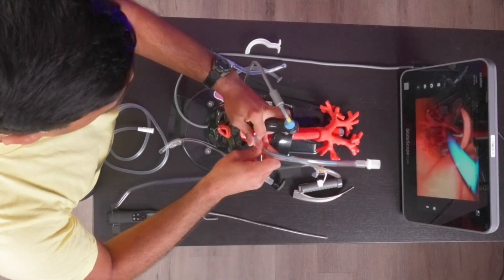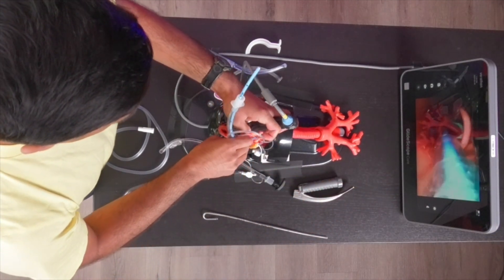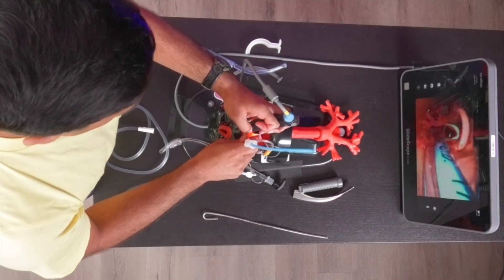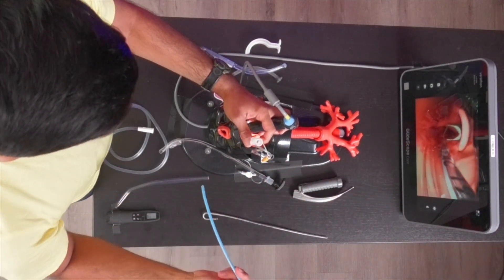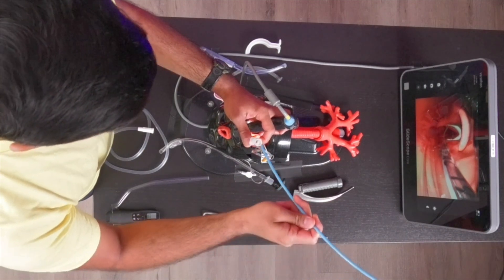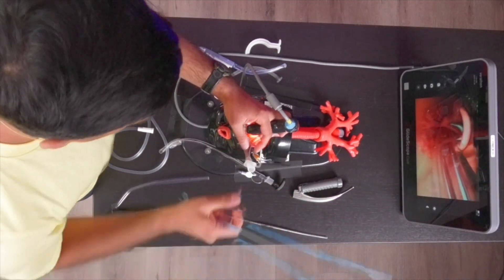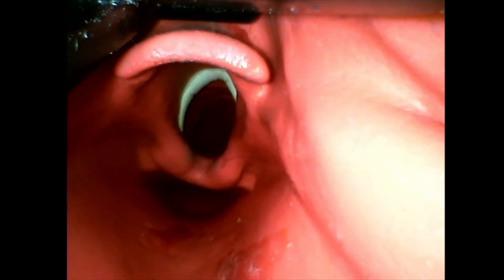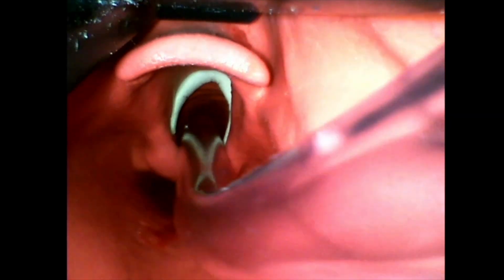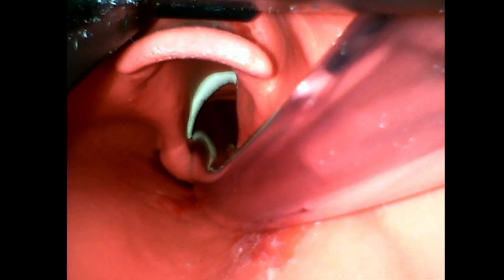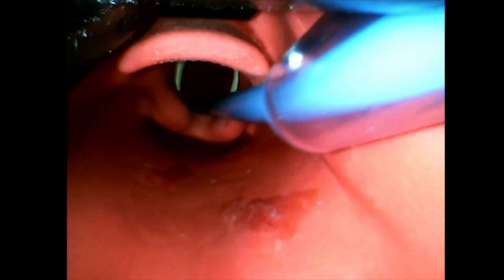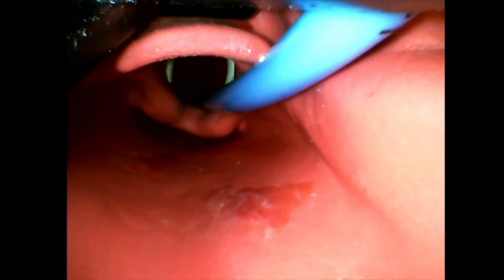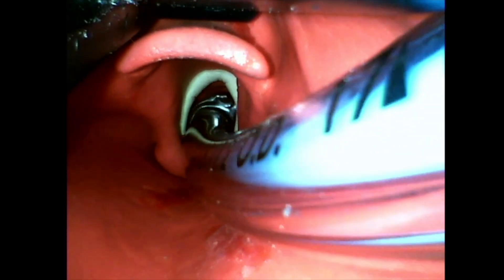Over this bougie, you can pass your endotracheal tube. It really helps to have an extra pair of hands to do this part of the procedure. I always recommend watching the tube pass instead of pulling your glidescope out with just a bougie in place. Once the tube is in, you can pull your bougie out. I'm going to do that one more time on the glidescope video. We've got our airway, we've seated the DuCanto catheter into the trachea. I'm disconnecting from the suction, passing my bougie through, pulling the DuCanto catheter out, and then railroading my ET tube over. There you've got your tube in place.